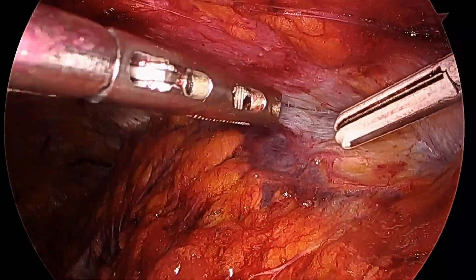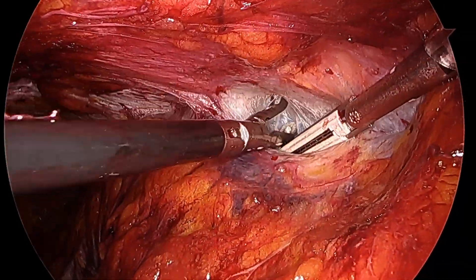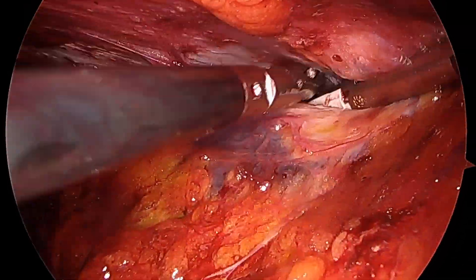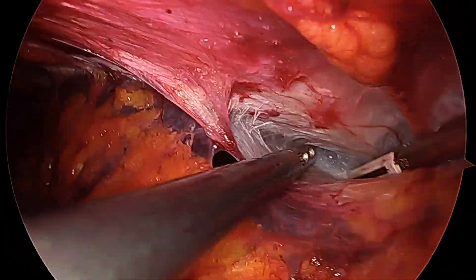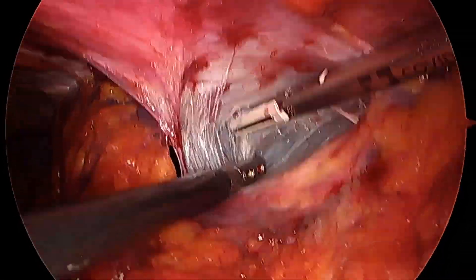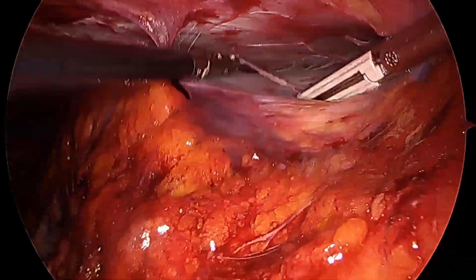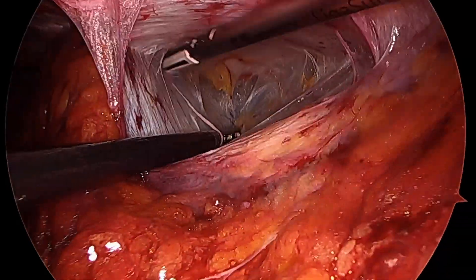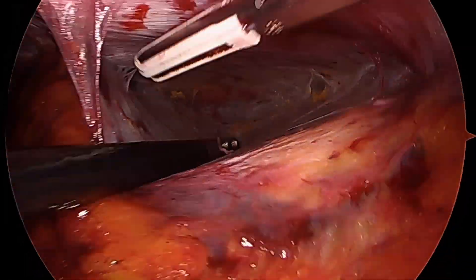We're going to do the same thing on the right side, and you can notice that most of this dissection is left 100% unedited. You can see that it actually doesn't take a very long time once you have figured out how to get into the correct plane. It's mostly blunt dissection because there aren't any big blood vessels in this area — it's just a matter of doing traction, contra-traction, being patient and allowing the CO2 to help you do part of the dissection.